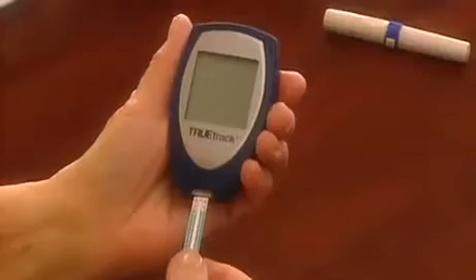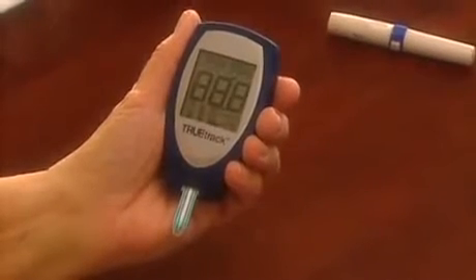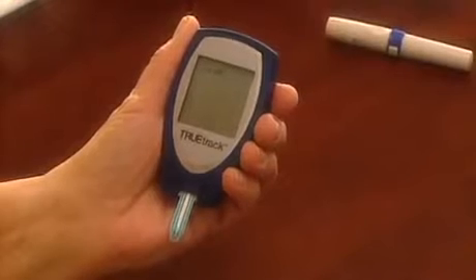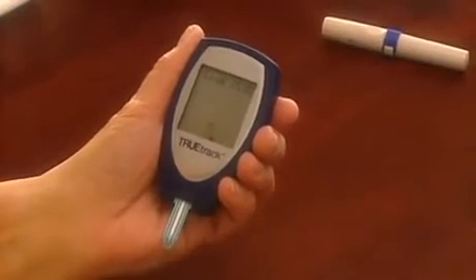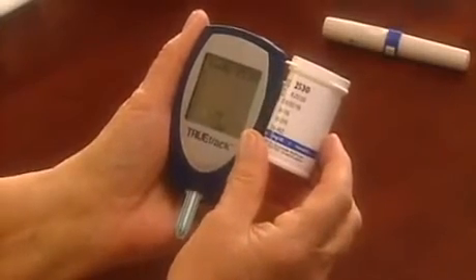Remove a test strip from the vial and immediately replace the cap. With the meter off, insert the test strip contact end, contacts facing up, into the test port. The meter will turn on automatically. Now match the code number in the meter display to the code number on the test strip vial.